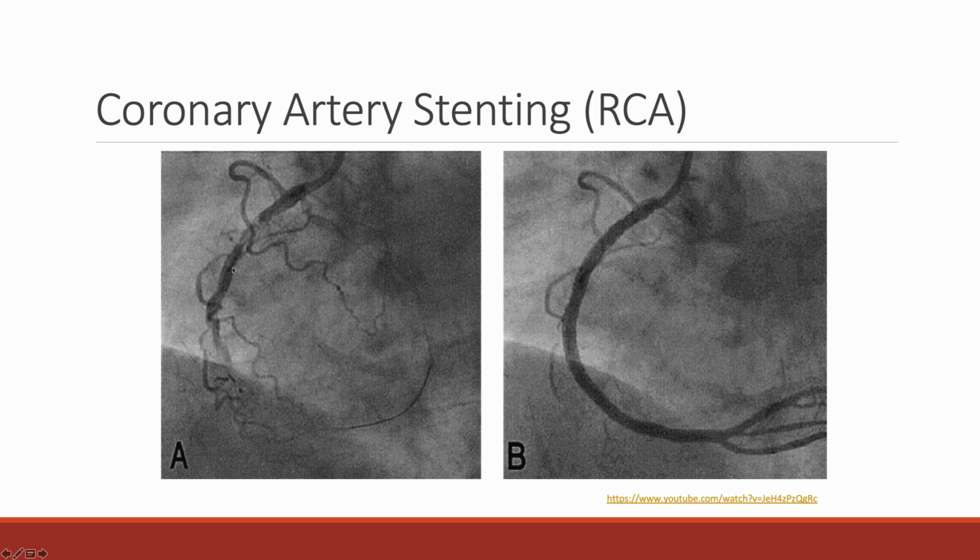And then here we have the resumption of the vessel, but then it gets all ratty down here, and then it actually disappears in this portion. What you see here is actually the guide wire that's in here. And then they put some stents in, and at the end, you have a nice open coronary artery that's supplying blood to the distal portion. And so you can see that the flow now has been much better restored in this section.